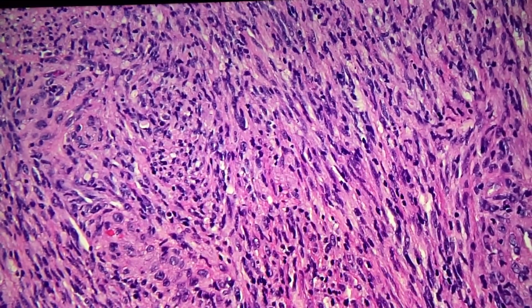Okay, so I think we have an infiltrative process. It's kind of basophilic spindle cells, kind of going in these intersecting fascicles. They're pretty atypical. Yes. So bland would not be the right term here, right?